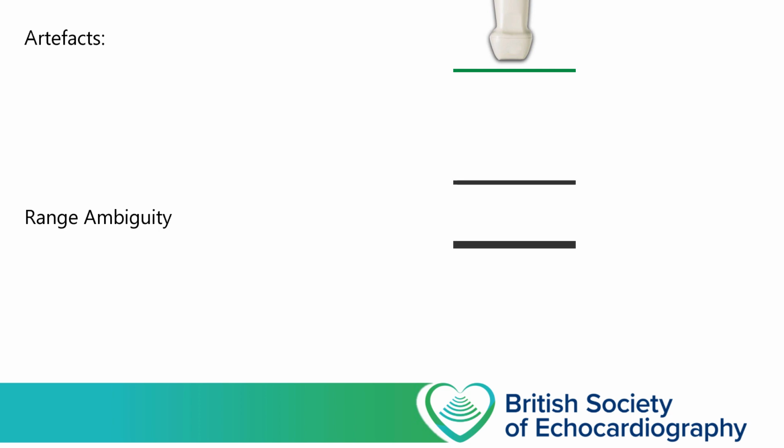So let's imagine that we're imaging our patient and these two grey structures here represent reflective surfaces within the patient. The first is 10 cm from the probe, and the second is 12 cm from the probe. So we start firing our ultrasound waves into the patient, and the first wave that reflects off the first line travels 10 cm into the patient, 10 cm back to the probe, and has travelled a total of 20 cm. So when the ultrasound software displays this on our screen as a structure, it estimates that this structure must be 10 cm away from us. Now, any energy that passes through the first line and is reflected off the second line will travel 12 cm to the second line, 12 cm back to the probe, total distance travelled 24 cm, displayed on our screen as a structure 12 cm away.